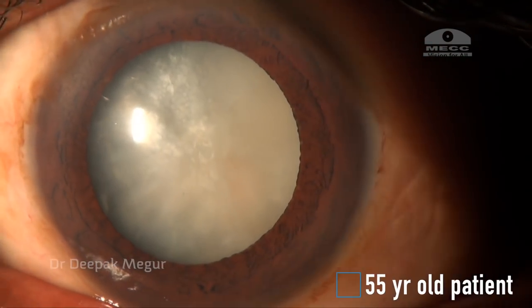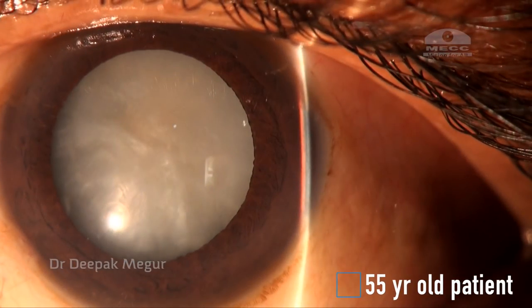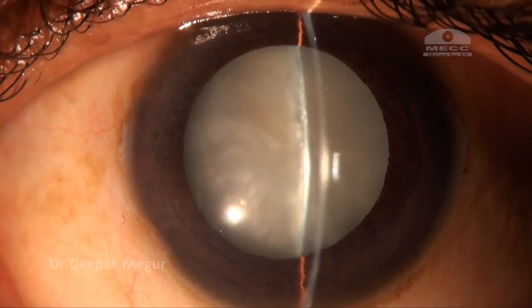Dear friends, it's not uncommon that we find ourselves helpless in certain situations. This is one such case. An intumescent cataract in a middle-aged patient. The anterior chamber is quite shallow. We can make out the tense anterior capsule.